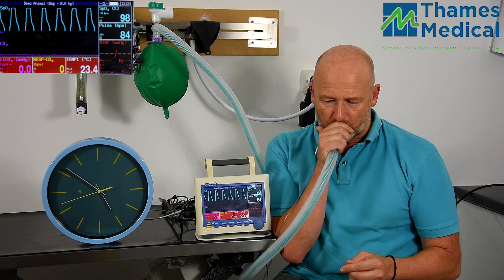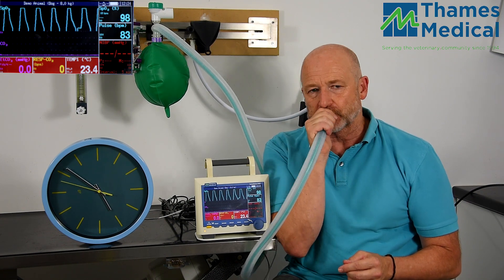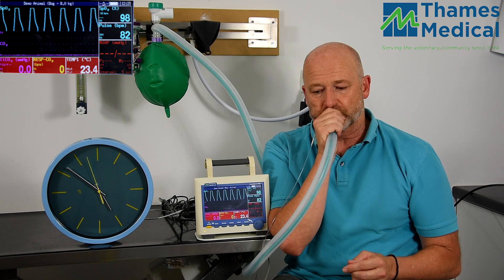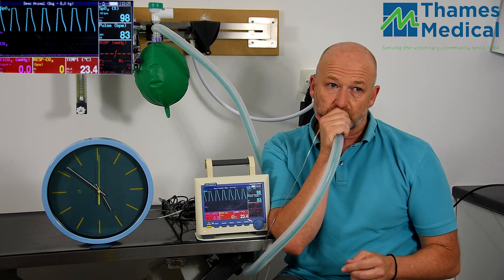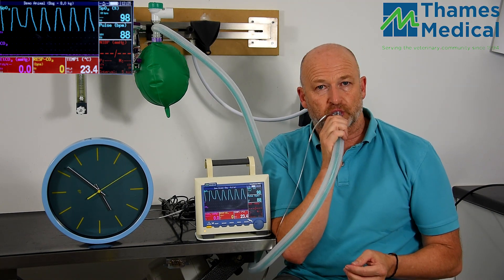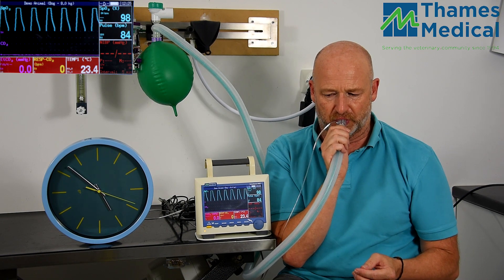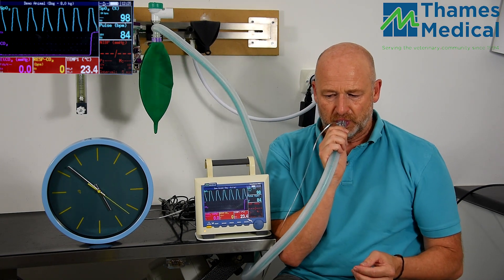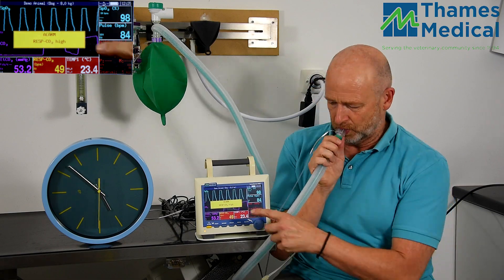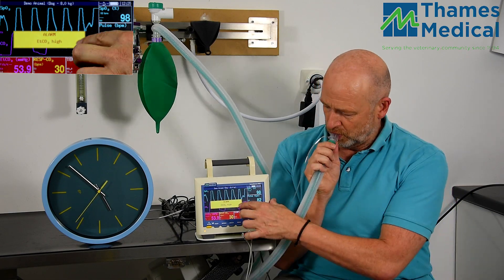The pulse rate and the saturation don't change. This film clearly demonstrates the benefits of three or four breaths of oxygen for every patient once they become available, before they go under anaesthesia and before they become apnoeic.